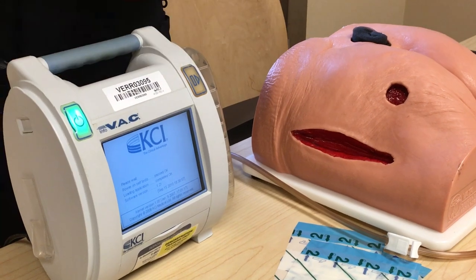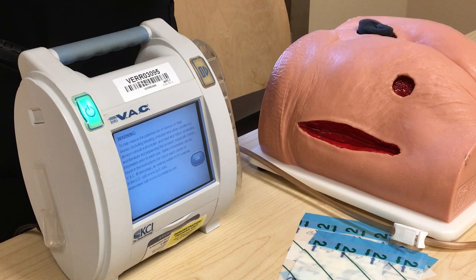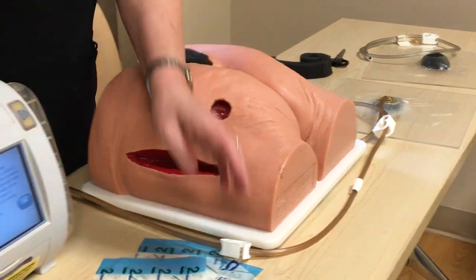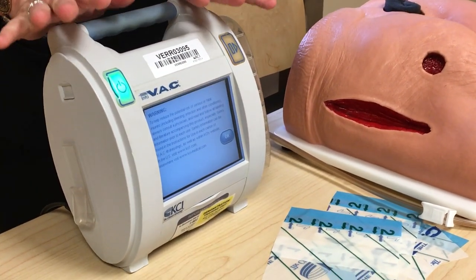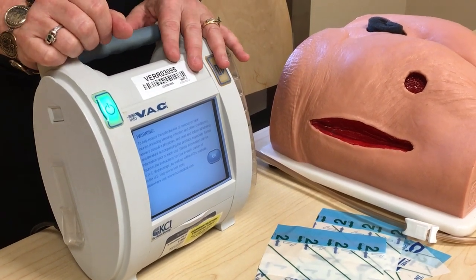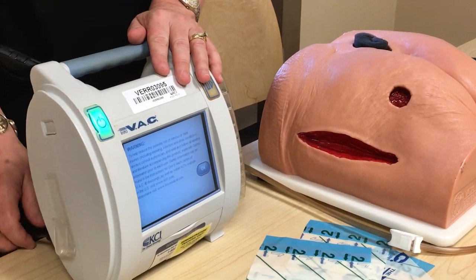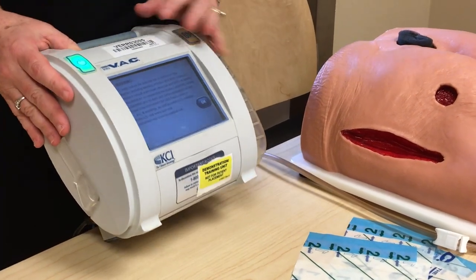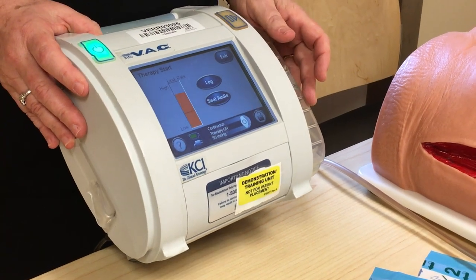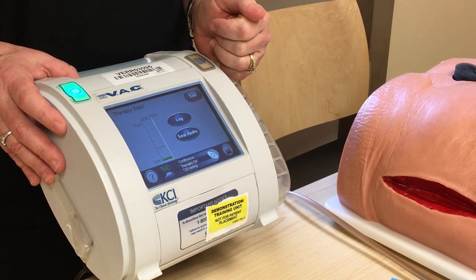The alarms you may get: canister full — change the canister if it's full. You may get a leak alarm — simply find where the leak is on the dressing, take a piece of drape, and patch it up. Another alarm may be canister inactive or therapy inactive, which means somebody paused it and didn't restart it, so you just need to restart therapy. You may also get a battery low alarm, so make sure the pump is always plugged in when your patient's in bed. Once the pump is on, push okay and you can turn the therapy on and off. This is a leak detector — it will tell you if you have a leak in your dressing.